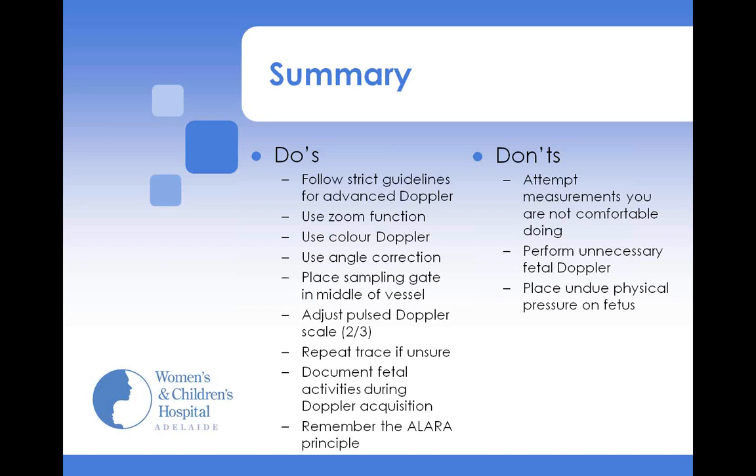So fetal breathing, fetal hiccups, fetal movement, and remember the ALARA principle, because it especially applies in pulsed wave Doppler, where the intensity of the ultrasound is 50 times higher. And if you have, like in MCA Doppler, a bone tissue interface, the heating effects can definitely be felt. And don't attempt measurements you are not comfortable doing, don't perform unnecessary fetal Doppler, and don't place undue physical pressure on the fetus.